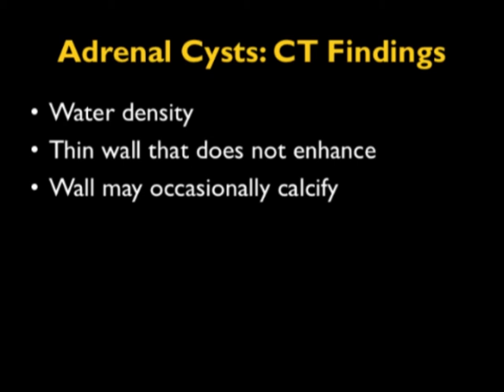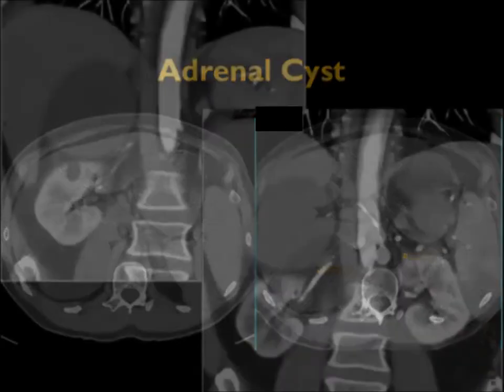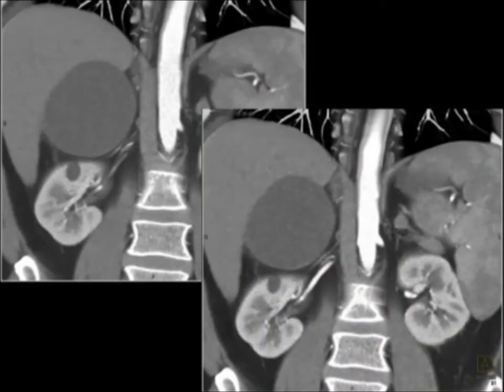Occasionally the wall will calcify, though that's most commonly in lymphangiomas as well as in old hematomas. In this example, when you look at that lesion with contrast or without, it's water density, well-defined, sitting above the right kidney, pushing on the liver — classic location for an adrenal mass. Being water density, this is a classic cyst.